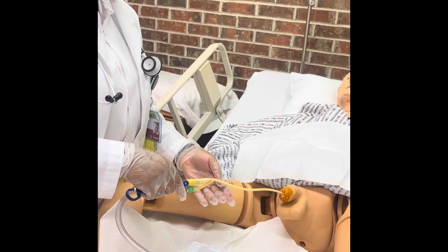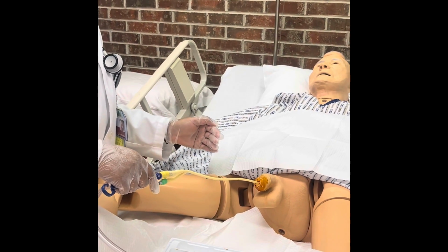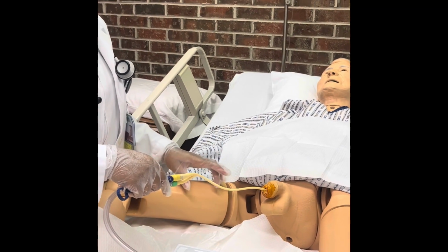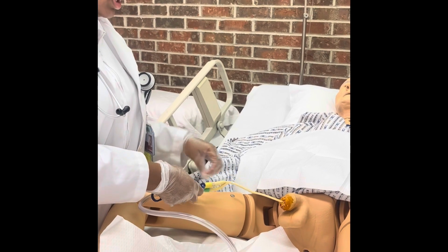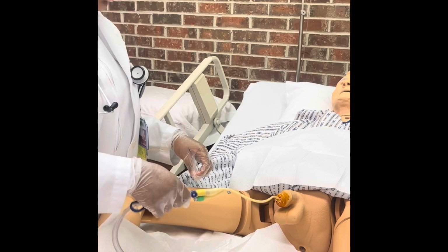You don't want to have it too tight or too taut, because then it could be uncomfortable for him, or come out. So when you have the perfect area on the thigh, you want to clean it with alcohol, clean it with skin solution, let that dry, and then you can attach your sticker, date, and time it.